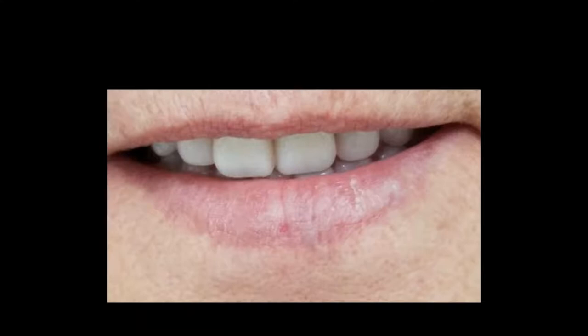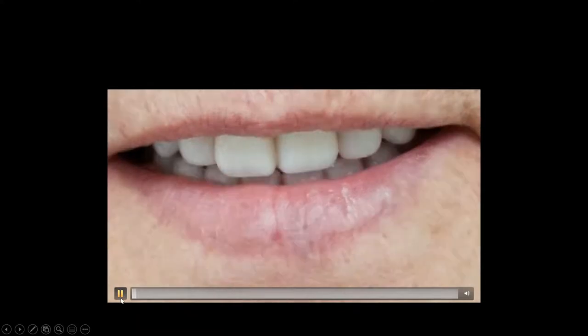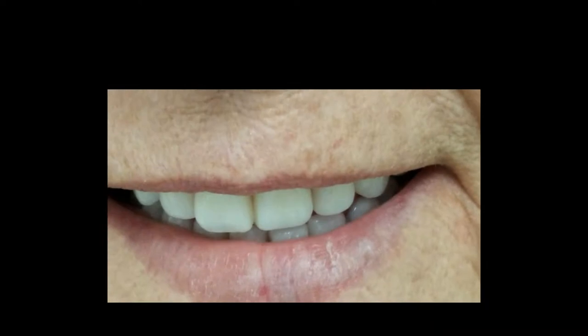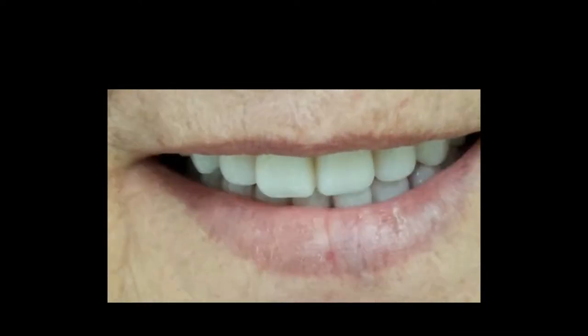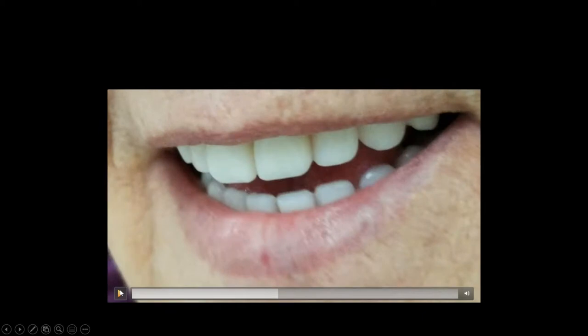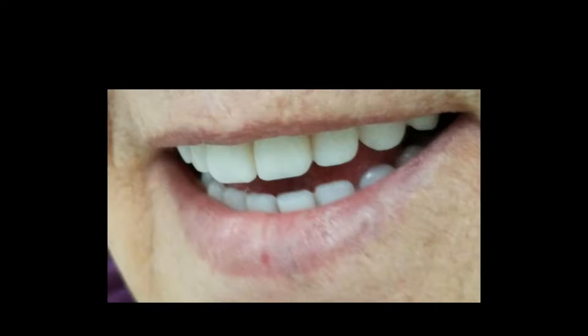And the phonetics is what's moving and posturing the jaw to pronounce that sound for that syllable. I'll run the video and you'll see what I mean. Now she's not doing days of the week and months of the year. She's saying 66. And you now can start to see the movement of her lower mandible.